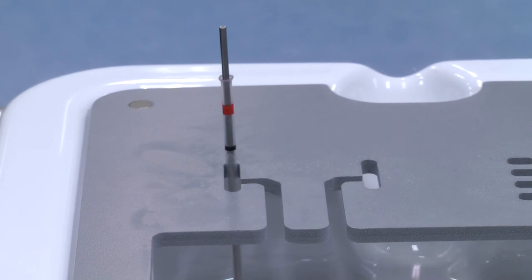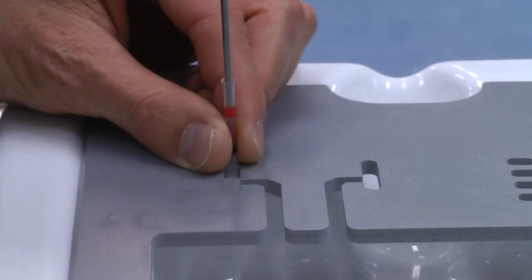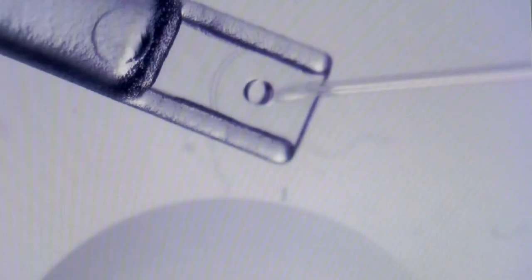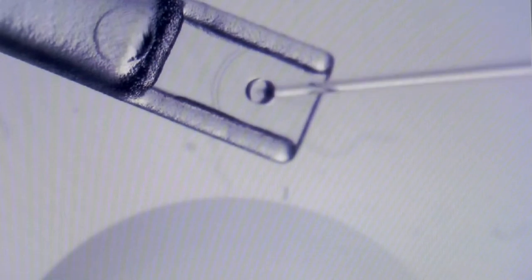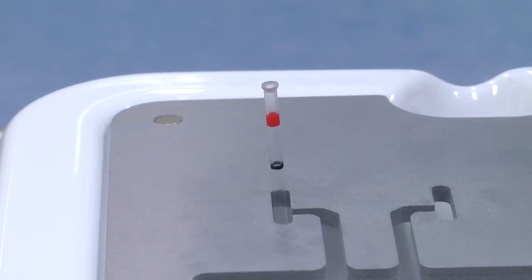Before loading the blastocyst onto the RapidEye, remove the metal rod from the RapidStraw and discard. Move the embryo from the media in the droplet and place it inside the hole with as little media as possible.